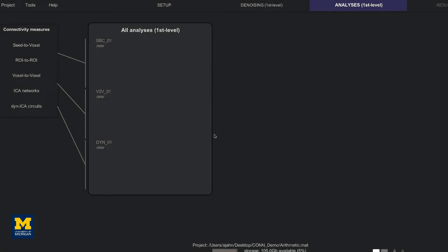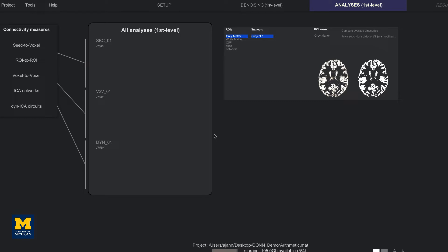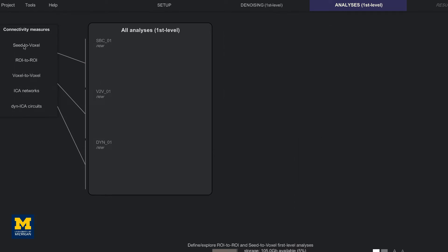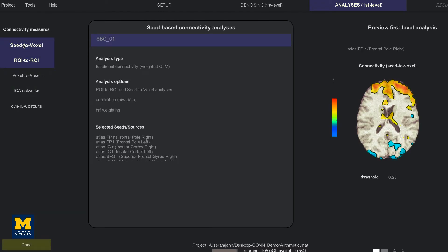When it is done, you will have access to the analyses first level tab, which automatically opens so that we can review the correlation maps. If you recall from the setup tab, several different ROIs were generated: gray matter, white matter, and CSF — the latter two primarily for denoising using an aCompCor. The atlases and networks ROIs parcellate the brain into different regions or seeds. The time series of the gray matter is averaged across all voxels in each seed, and correlation maps are generated for both the correlation of that seed to all the other seeds and of each seed to all of the other voxels in the brain. Clicking on the seed to voxel or ROI to ROI buttons will display two distinct areas in the window, similar to the setup in the denoising tab.